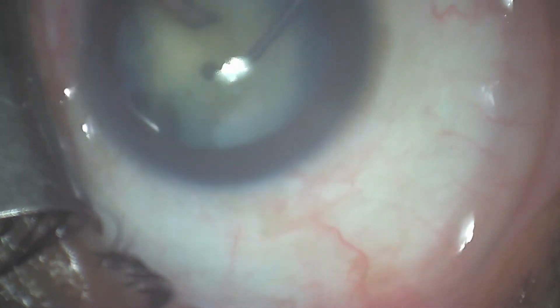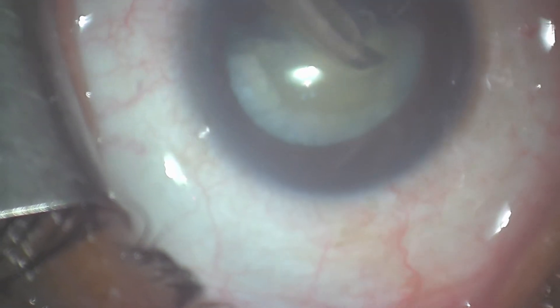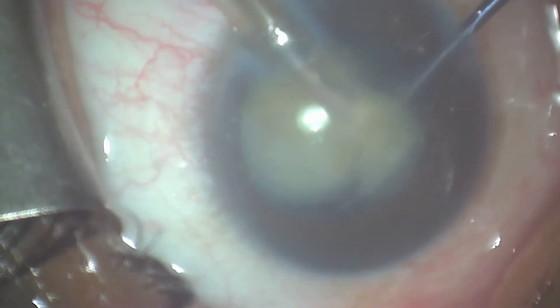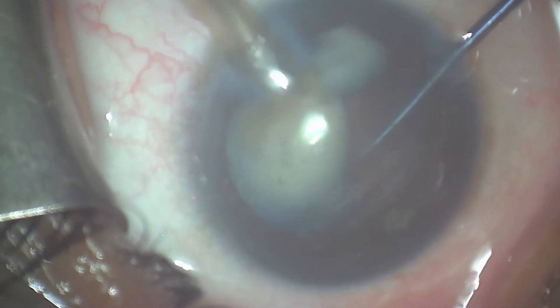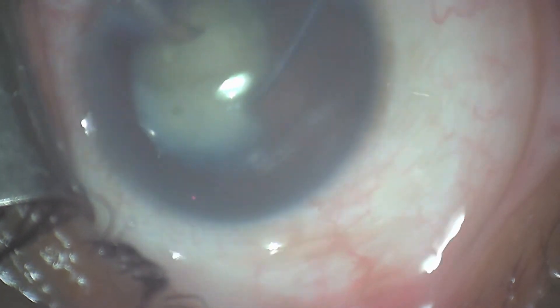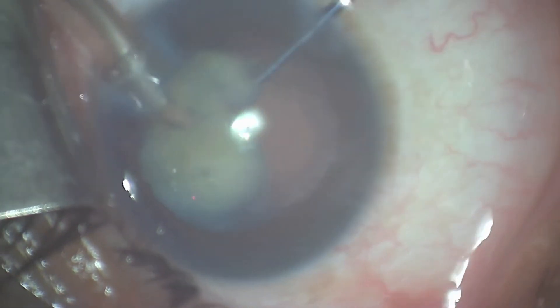That results in less energy transmitted to the endothelium and of course a safer procedure. For the second half of the lens, I will emulsify and chop it as necessary so that I can create smaller pieces of lens fragments that are easier to manage and manipulate. Here you can see some chopping taking place in the posterior chamber, well away from the cornea, also in a safe zone and protecting the posterior capsule utilizing the second instrument.